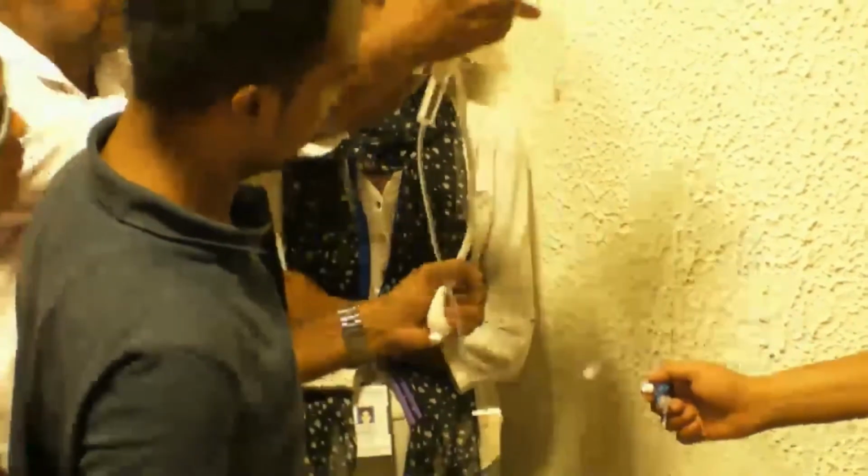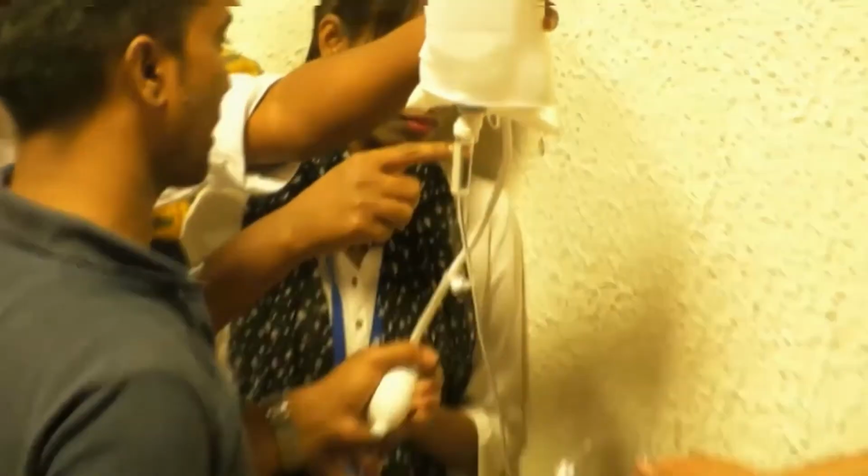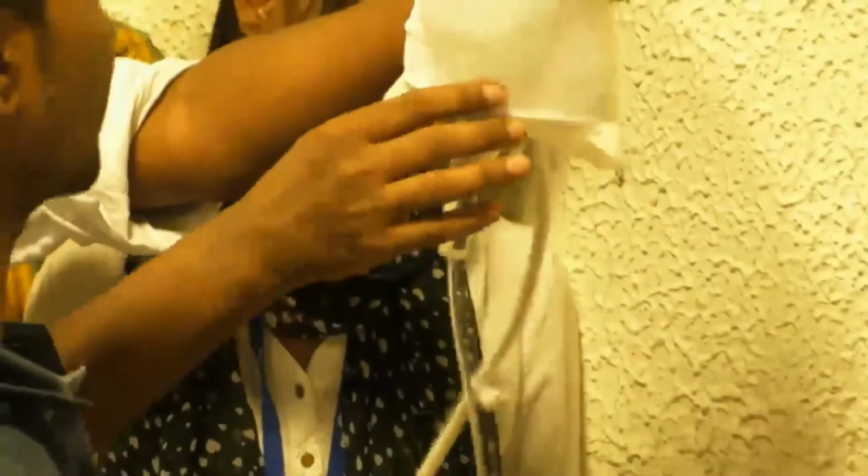And making it air free is a religious process, because if it's not air free, I have shown you what happens if it's not air free.